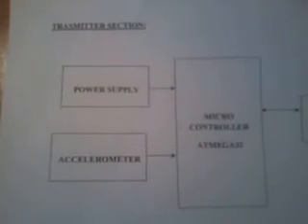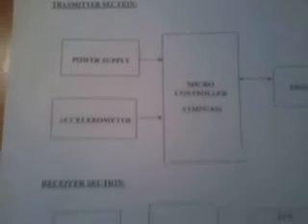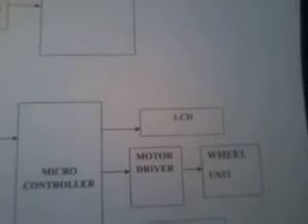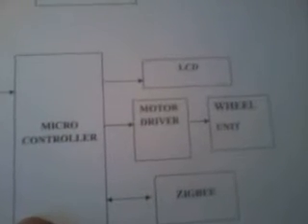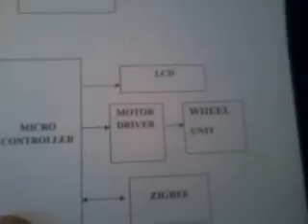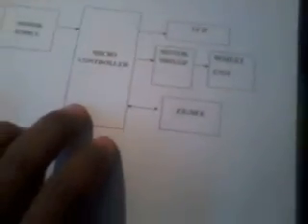This entire section is called the power supply unit. In the receiver unit, I am using an ARM processor LPC2148 microcontroller, a power supply section, one 16x2 LCD display, one motor driver circuit — the L293D driver IC — one wheelchair circuit, and one Zigbee module.